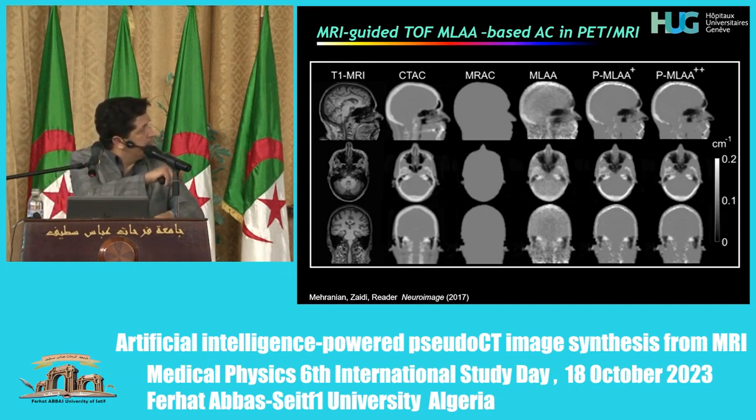Then we did some developments as well to develop a priori knowledge that can be incorporated and enforced in the form of penalty functions, so quadratic penalty functions, to improve the performance of the MLAA estimates. And you see that the produced attenuation maps are less noisy.